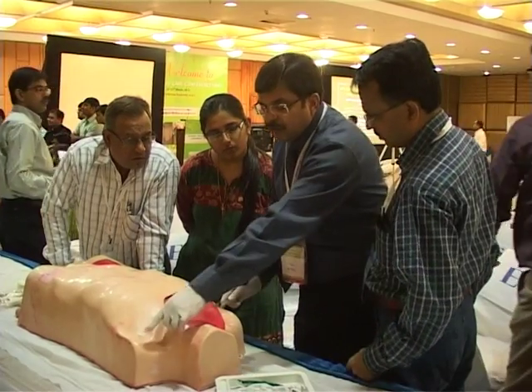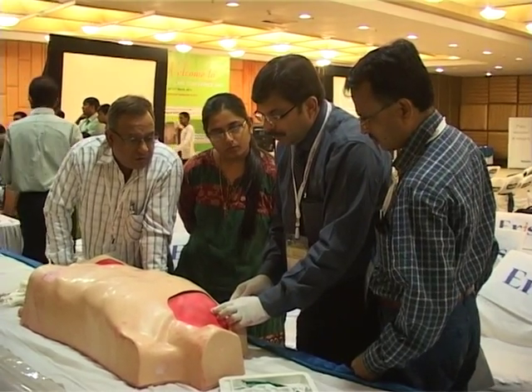Go just below the clavicle, toward the opposite shoulder. Okay?